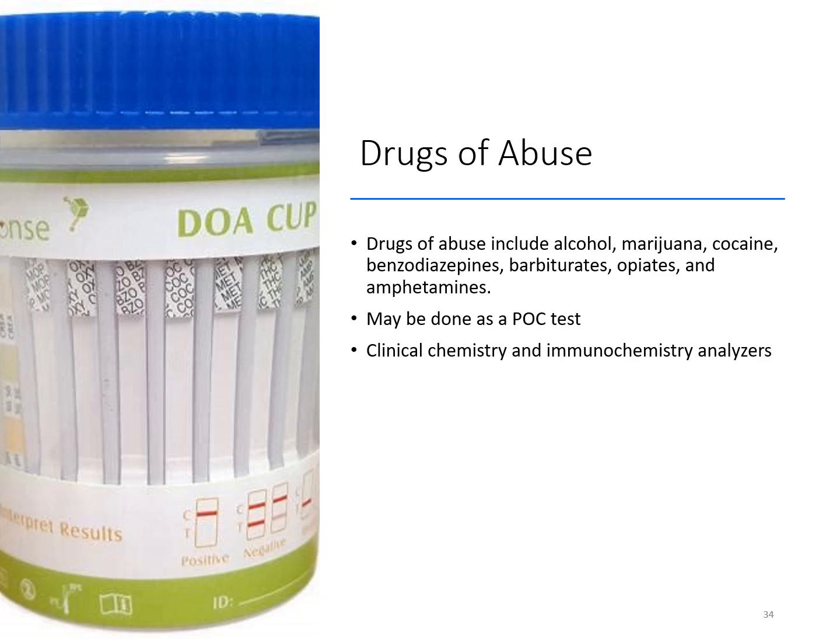Or it can be done through a little bit more complex testing through several different chemistry analyzers that you can find in most basic hospital labs. Or it can be some complex type testing, which can include any sort of immunochemistry analyzer, even gas chromatography.